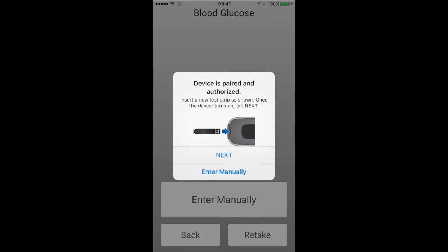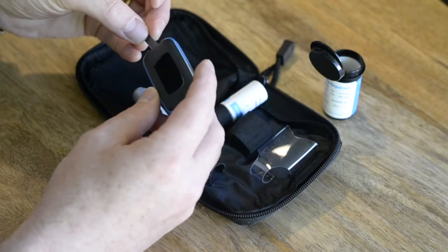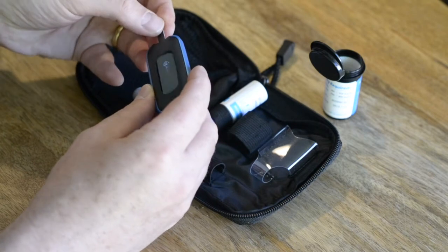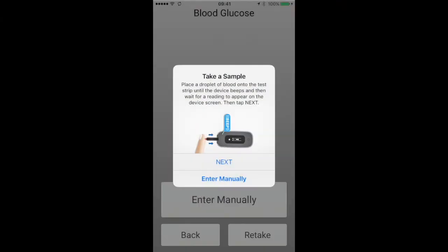Next, follow the on-screen instructions on how to take your sample. Carefully insert the test strip into the device as shown. Once correctly inserted, the test strip will cause the device to turn on.